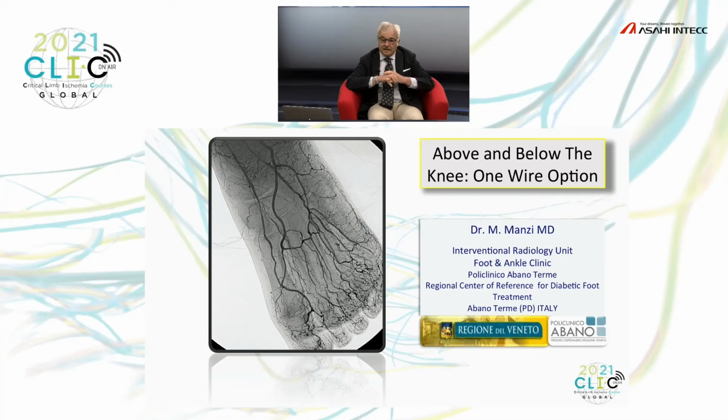So I would like to start with the recorded case. The title is Above and Below the Knee One Wire Option.